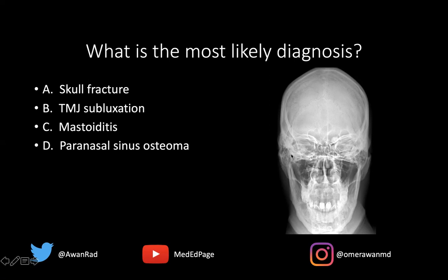If we take a look at the mastoid air cells — these are the areas right here — they're well aerated. There's no opacification of the mastoid air cells bilaterally to suggest mastoiditis. So that leaves us with a paranasal sinus osteoma, which is in fact the right answer. This is the right maxillary sinus, the left maxillary sinus.